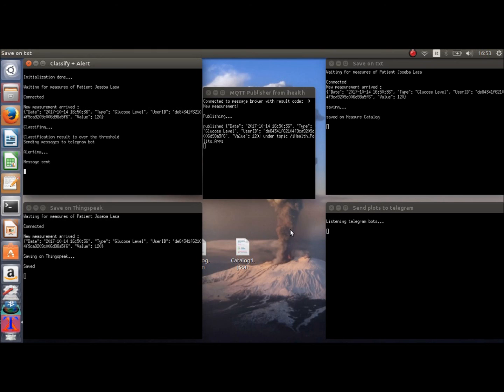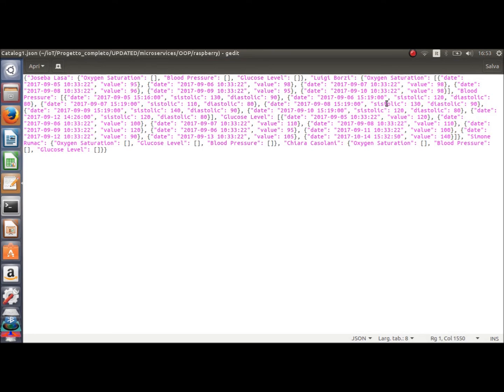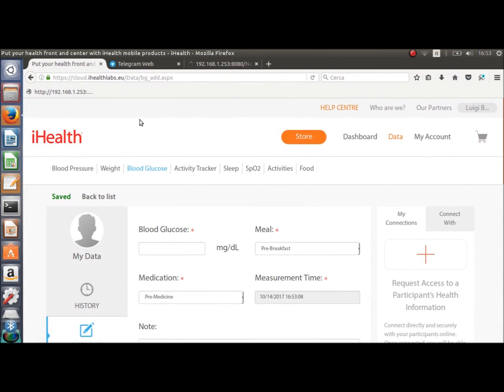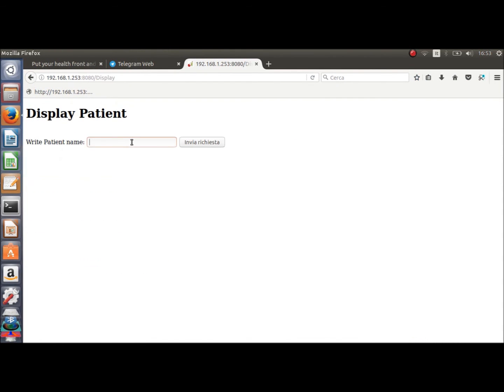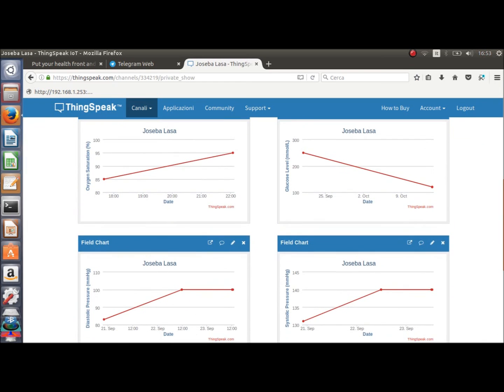Okay, the message arrived. Let's check if it was saved in the right position. Yusuf Balasa, this is it. And now we can check for the ThingSpeak channel updating by reaching the web service and Show Patient Data, typing the patient name, and let's check it. This is it.